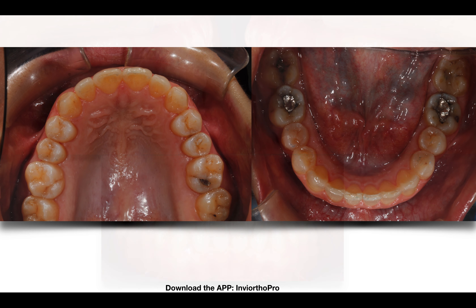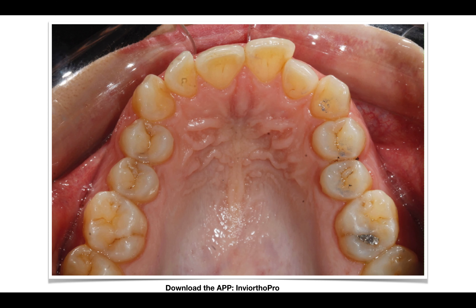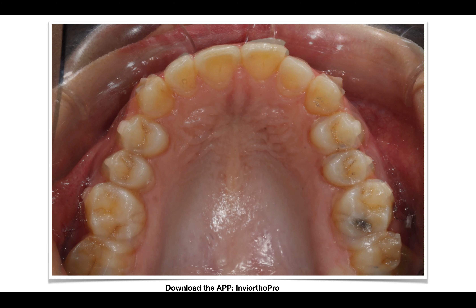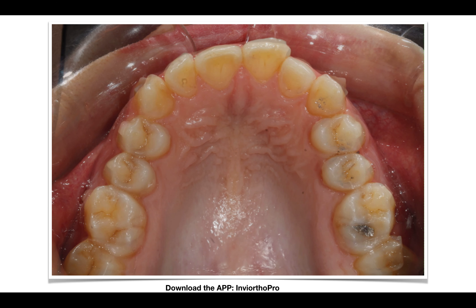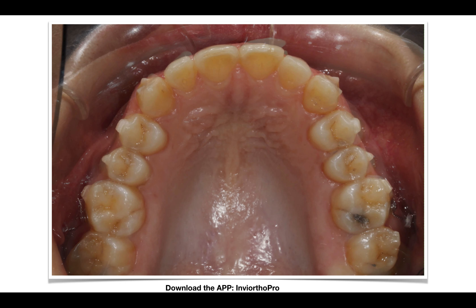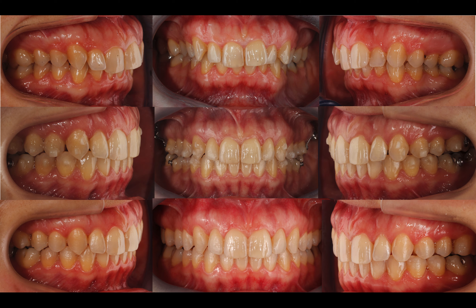The arches show a good arch form, and something beautiful — you can see the way I did the expansion. Remember, that's something I always say: you have to expand the buccal segments, the lateral segments, at the same time as we are doing distalization of the 7s. You can see the movement and the evolution. The crowding, the severe Class 2 on both sides, and also the upper midline was canted — in the middle picture are the attachments at the end of the case.